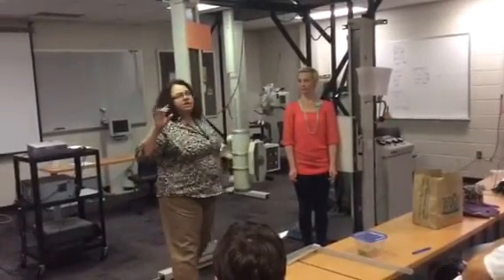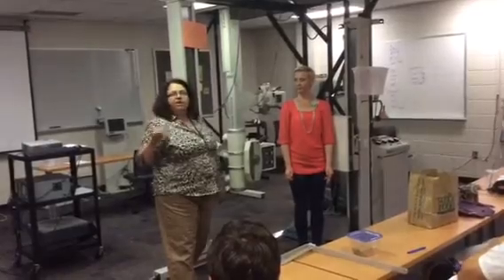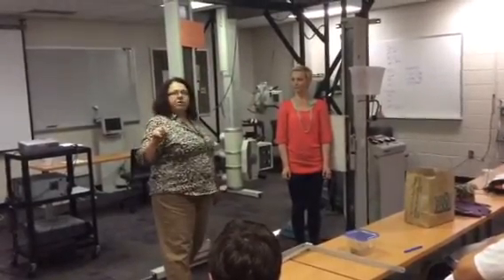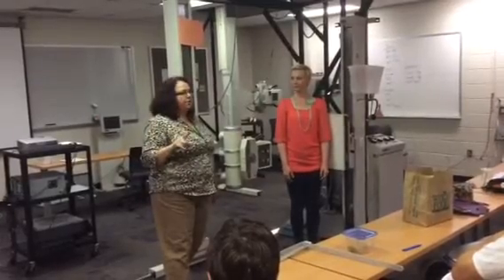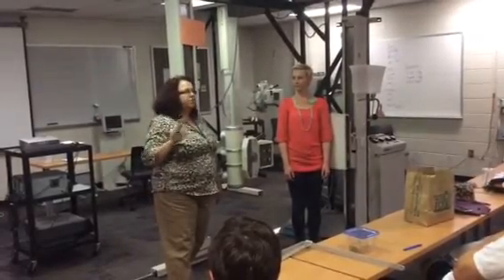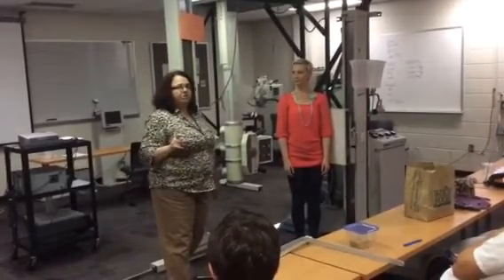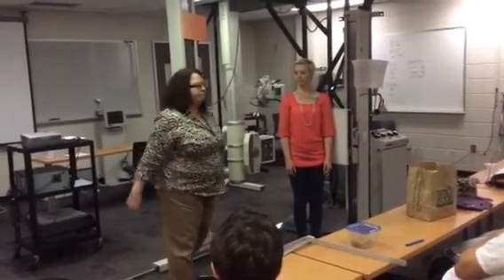For the oblique, it's going to say, do the lumbar oblique that demonstrates, and I'll have either right pars or left pars on there. Now, how you do that is up to you. Whether you do posterior, anterior obliques, it doesn't matter. You just have to do the one that demonstrates the pars I ask you to demonstrate. That's it. Okay?